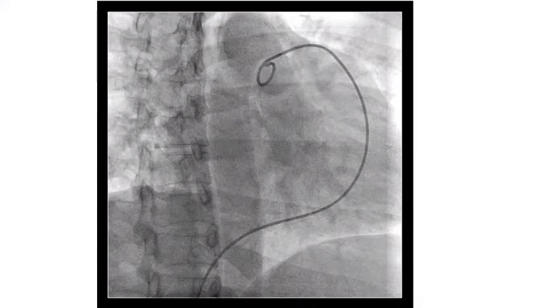When do you do RAO view? When you want to separate atria from the ventricle. So in patients with mitral regurgitation or tricuspid regurgitation, if you want to evaluate, you should do an RAO view. So RAO is to separate atria from the ventricle, and LAO view is to separate right from the left. When the spine is seen on the left side of the image, it is an RAO view, and when the spine is seen on the right side of the image, it is an LAO view. So this is an RAO view.